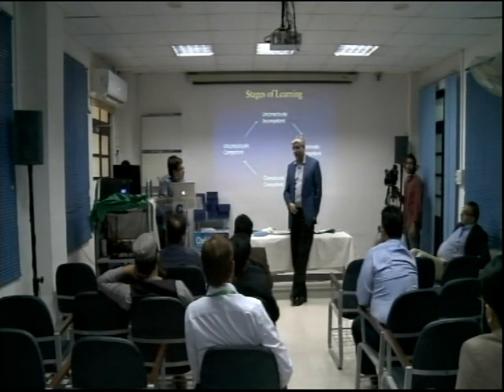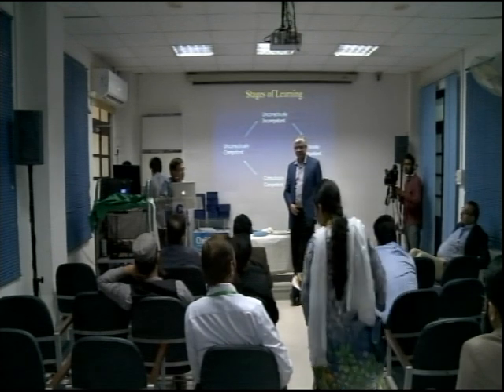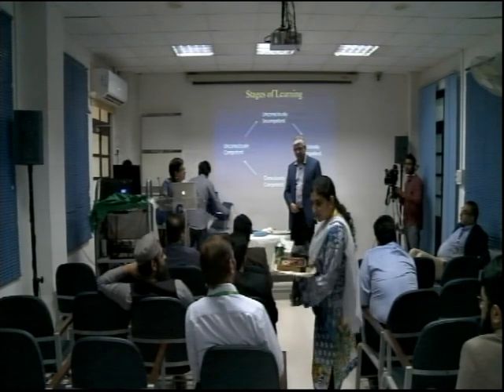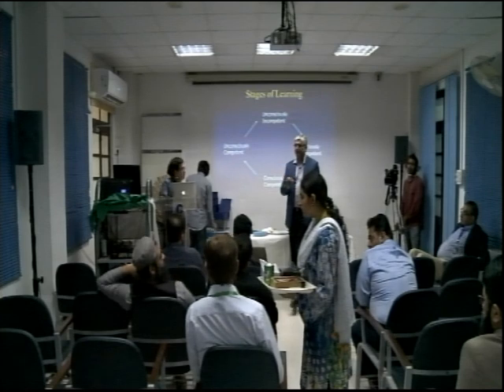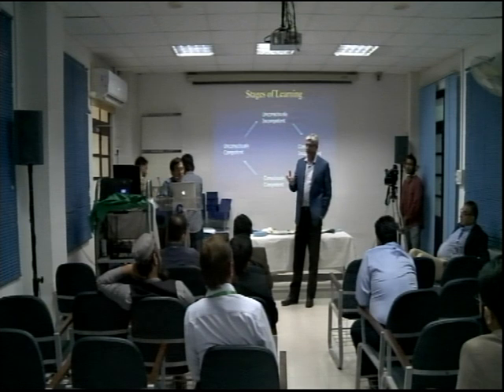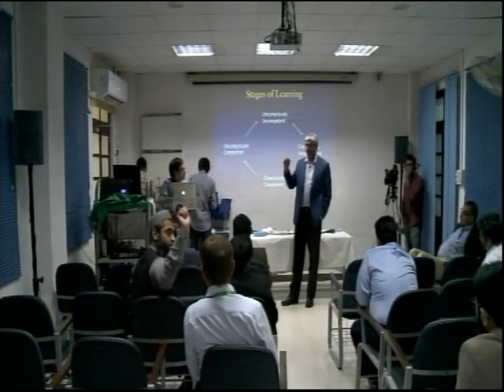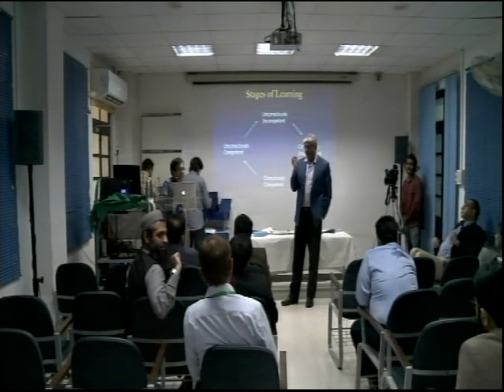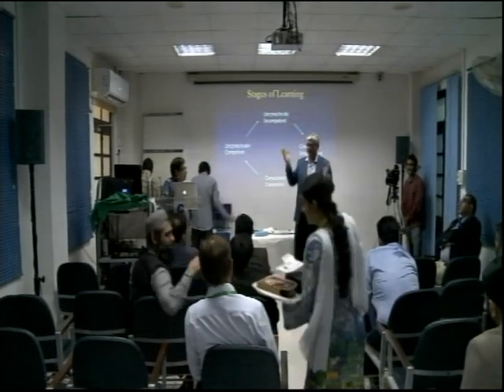We don't do a lot of cases, but we do a significant number, and we have published on needle knife already. I said, no, it's not a problem. It's about what you are comfortable with. First, what is the ampulla like? I would be very worried doing a needle knife fistulotomy in a small papilla. I can literally put my needle in through the ampulla and just gently dissect.